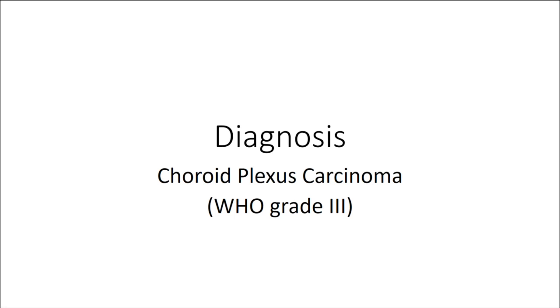The diagnosis was also choroid plexus carcinoma, WHO grade 3. Wanted to show you several different pattern variations in this tumor. What are the hallmarks? Young age. Choroid plexus carcinoma is almost always limited to very young patients.